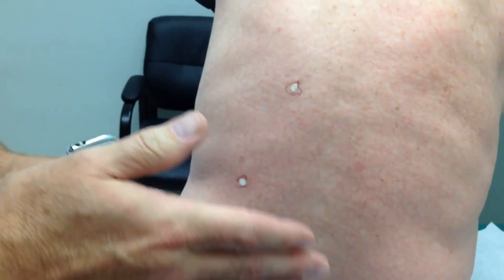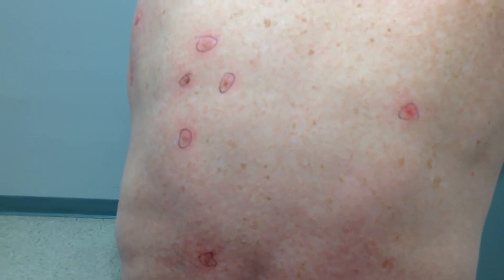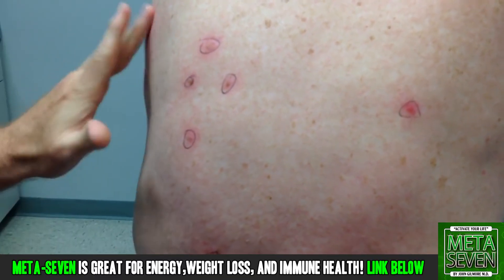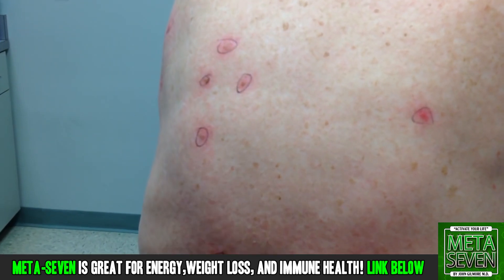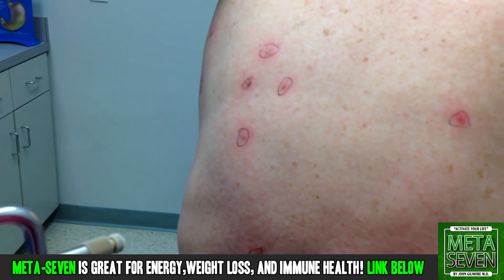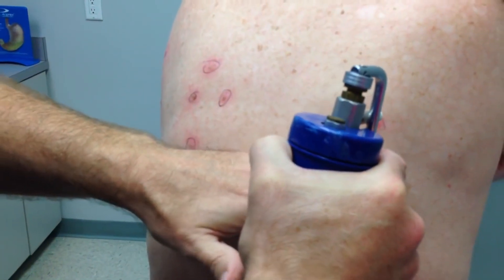We're gonna do a timeout now and zoom in the video closer so you can see. What we have to do with these actinic keratoses is complete two freeze-thaw cycles. We've done one, and right now by just feeling we can tell they've warmed back up — they've thawed. So now we're gonna start the second round of freezing, which unfortunately for my patient has proven in the past to be more painful than the first one.